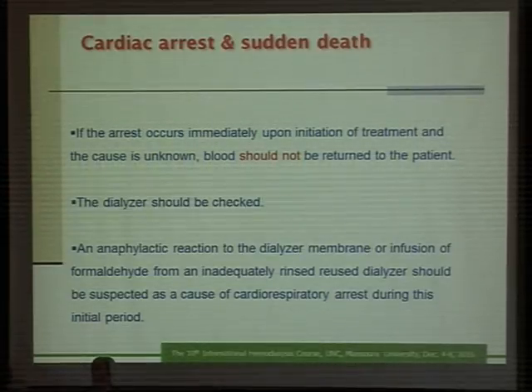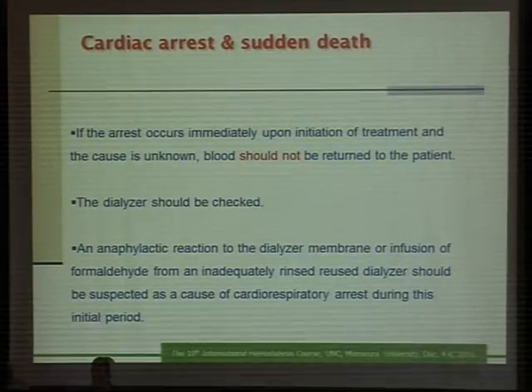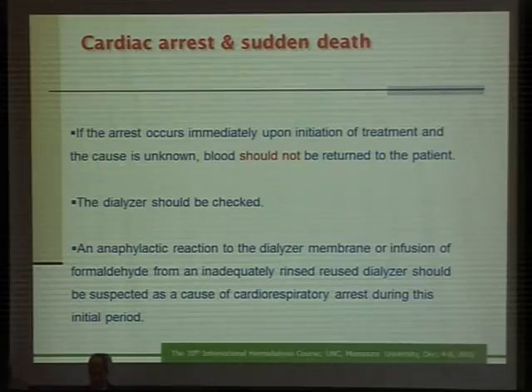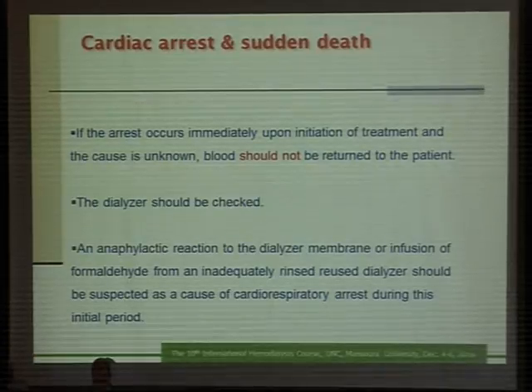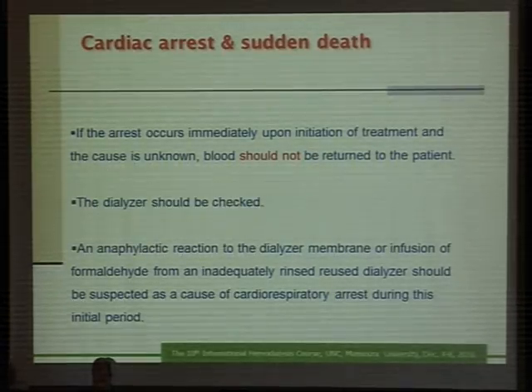An anaphylaxis reaction due to the dialyzer membrane, or infusion of formaldehyde from an inadequately rinsed dialyzer, should be suspected as a cause of cardiorespiratory arrest during this initial period.